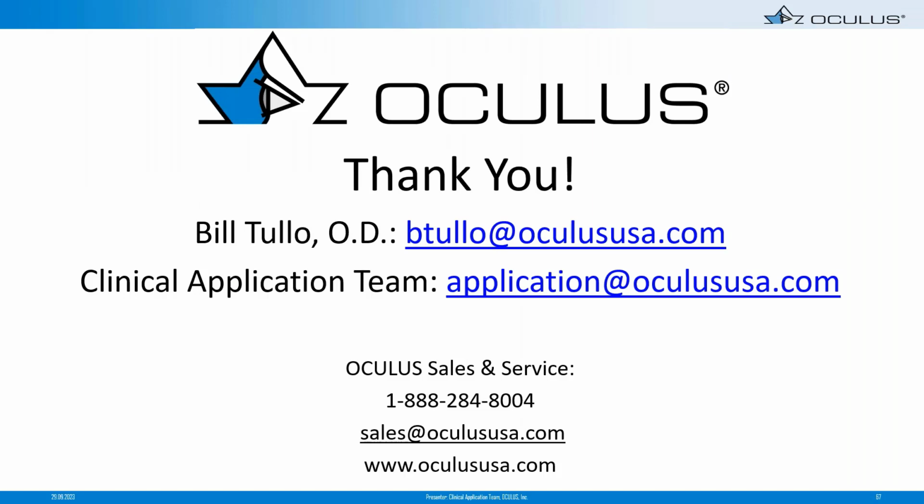What a great answer, Bill. I wanted to follow up on that just a little bit more. Say you aren't looking at this patient in terms of performing surgery, but say just screening for keratoconus. Would your guidelines there be a bit more flexible?